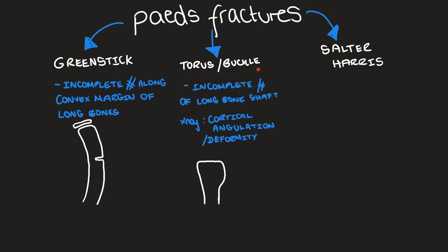Torus or buckle fractures occur due to axial loading injuries, which cause incomplete fractures of the long bone shaft. On an x-ray, you'll see subtle cortical angulation or deformity. This diagram demonstrates what kind of appearance you're looking for — this is the bump or angulation you're looking for.